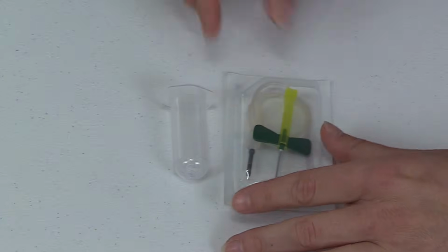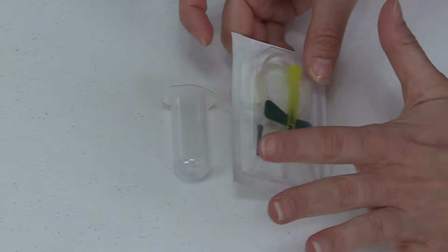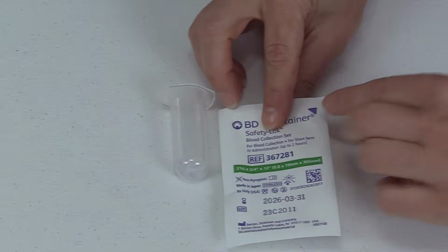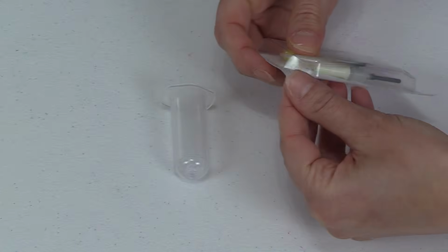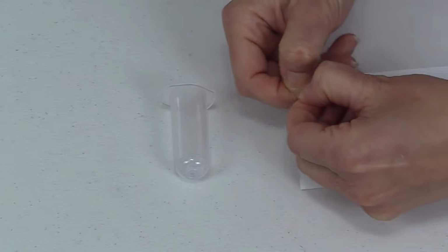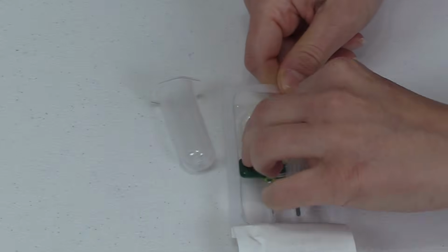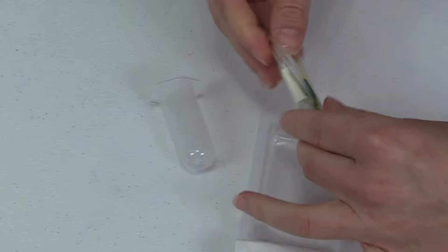So I'm going to open this up. I'm not going to actually use this for the actual blood draw, but I just want to open it up so I can show you the parts of it. To open it up, you're going to find an arrow on your packaging. You're going to peel that back. Just hold that and then just peel it open. So let's look at these parts up close.